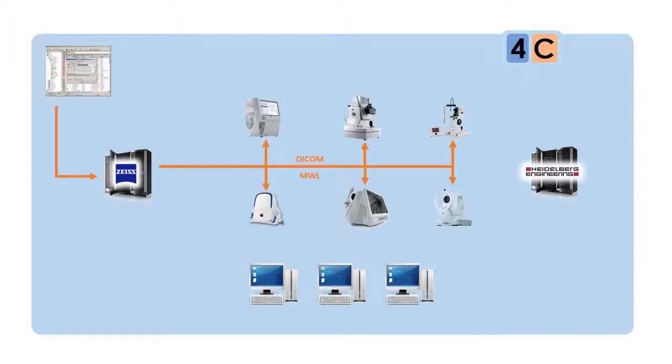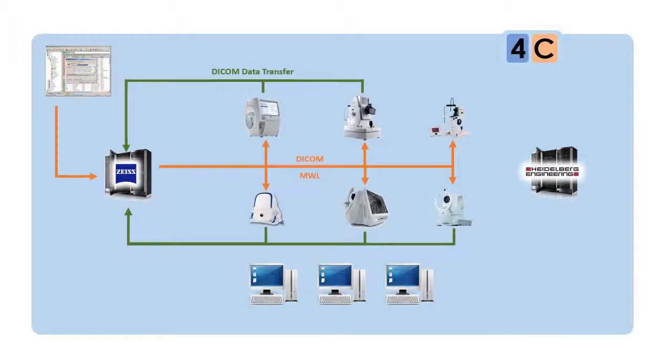Once the scan is complete and save or export is selected, the data gets then sent back to the primary ophthalmic PACS. Or in the case of this image, these 5 devices send their data to the primary PACS, but the Spectralis data is sent to Heidelberg Eye Explorer. And that's just a reflection of the fact that Zeiss OCT devices can be interrogated to the highest standard with Zeiss software, and Heidelberg Spectralis OCT scanners, their data is best viewed on Heidelberg Eye Explorer.